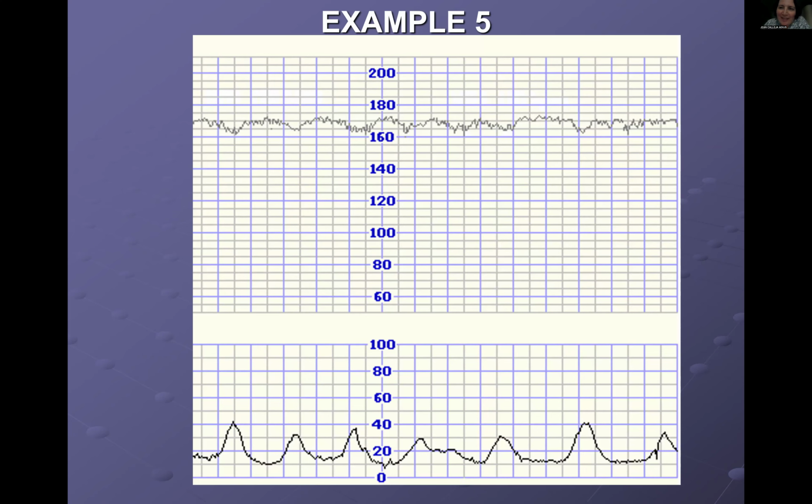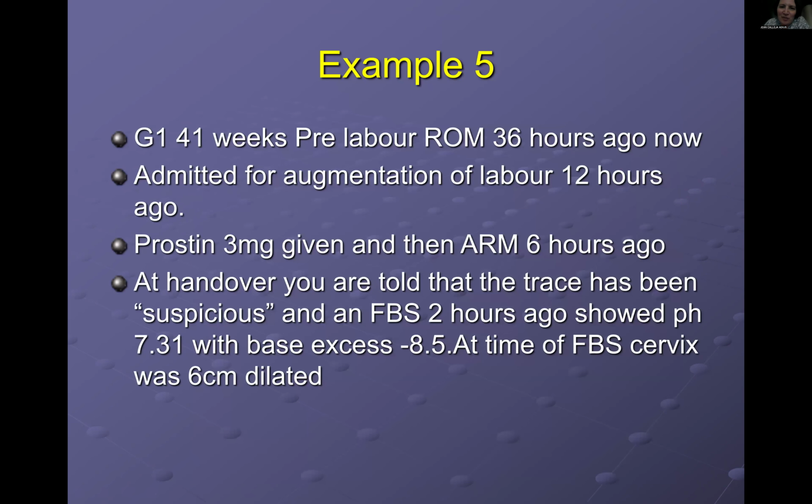So who's going to volunteer? Maybe Philip, would you like to have a go at describing the CTG? Yes, Prof. We can go through. Thank you. So let's go to her history. Is she low risk or high risk? Okay, so this case is also a high risk case. Definitely high risk. Exactly.